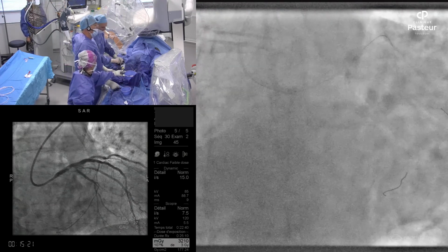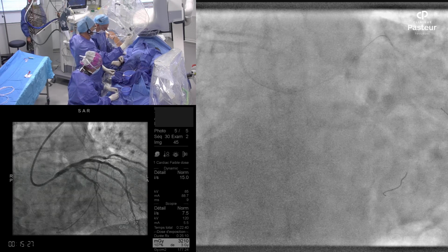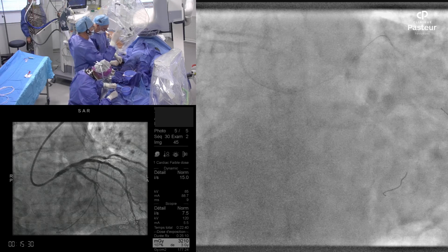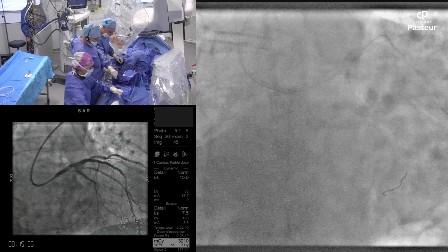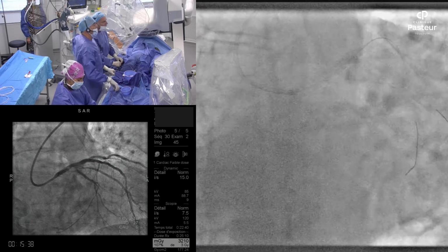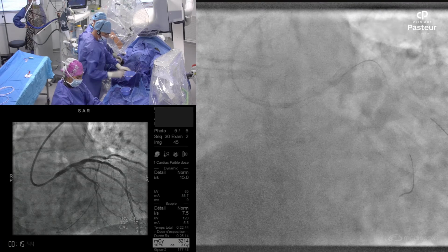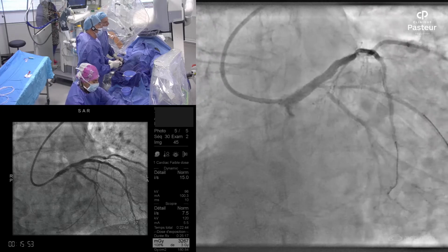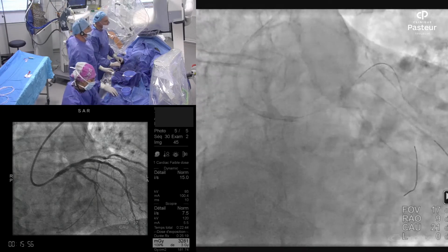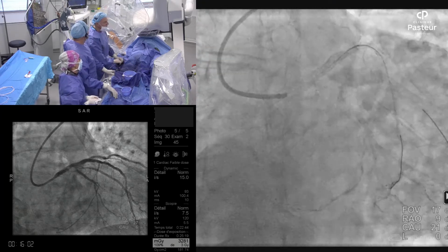Oh yeah, because when you look at the initial baseline angiography, you have the diagonal, which was 2.5, LAD, which was 3.5, plus OM branch, plus the distal circ. So definitely we are close to 5 millimeter for the left main. So let's see. This is okay, this is correct, but we are 4.3 after the post-dilatation, and if we can inflate with a 5 millimeter, it should be okay.